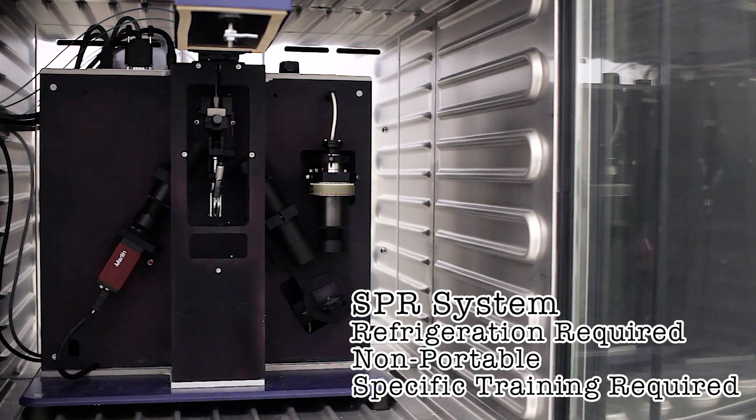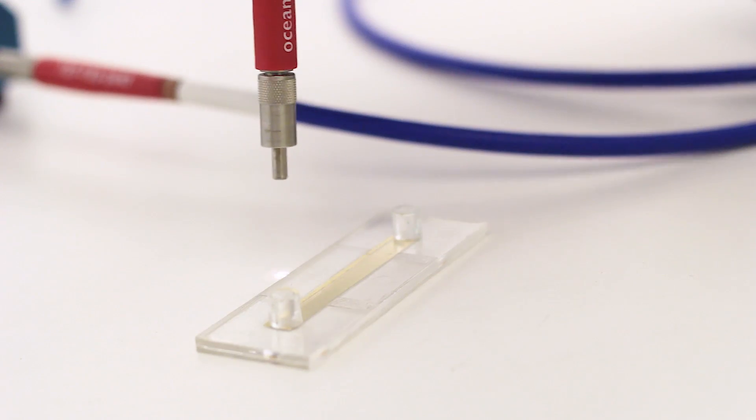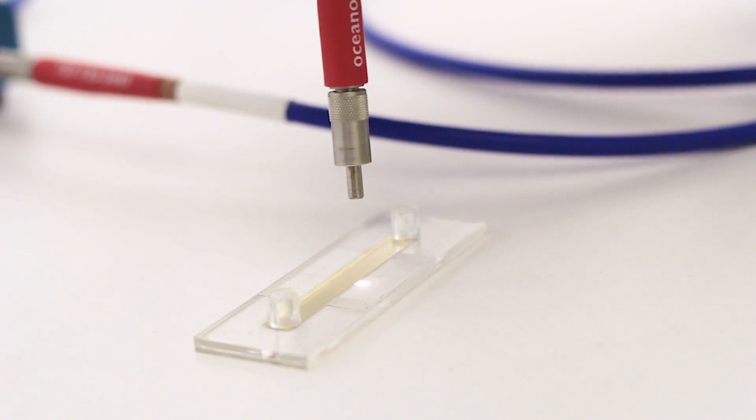Our research focuses on making an inexpensive sensor that will fit in the palm of the hand. The nanostructures we add to the metal films allow for the laser and fancy optics to be replaced with a simple lightbulb and camera.